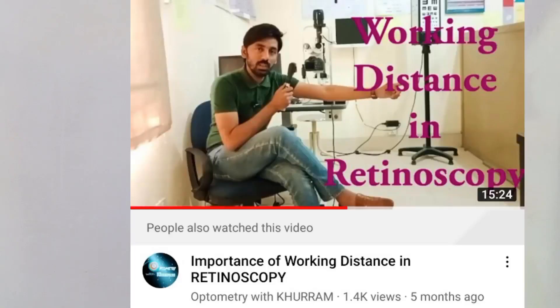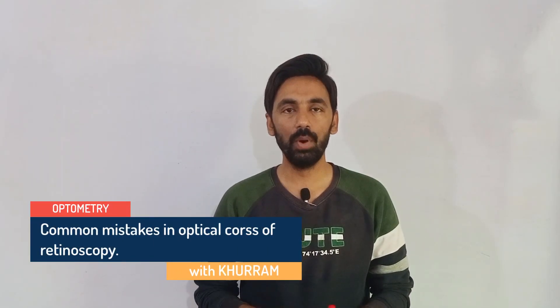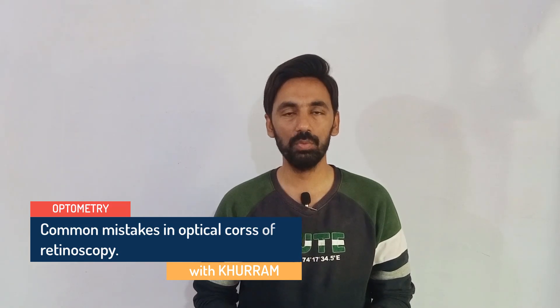Today's topic is about the optical cross of retinoscopy. We have recorded many videos regarding retinoscopic procedures, but this specific video is about the common mistakes and confusions while establishing the optical cross of retinoscopy. These mistakes are commonly made by students while performing retinoscopy. There are two specific methods for establishing the optical cross of retinoscopy, and we are going to learn both techniques.